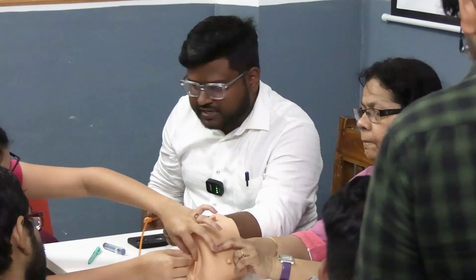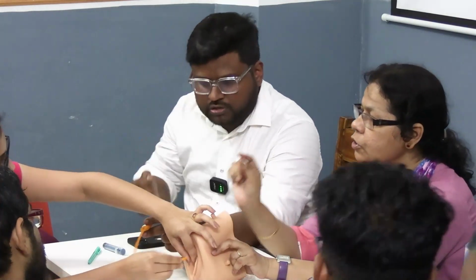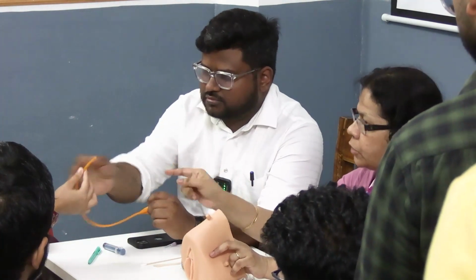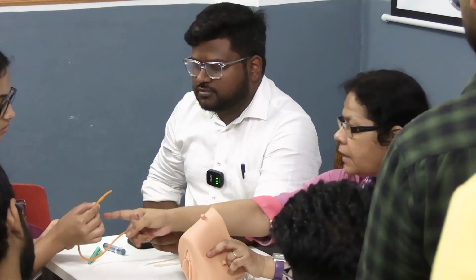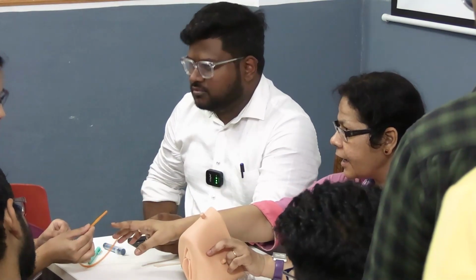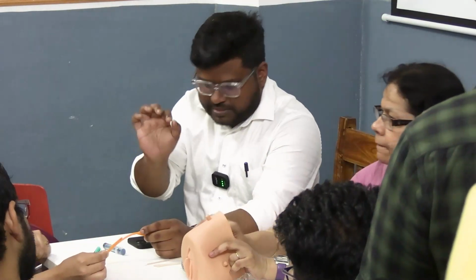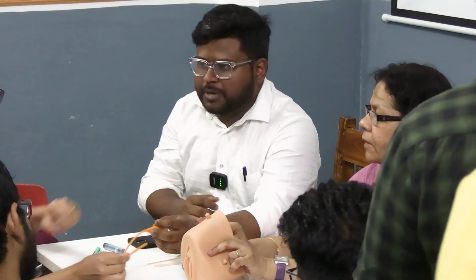If you're holding it at the tip, you will not be able to insert. Hold it a little distal from the tip. There is a reason why you will do this. Because this part is sterile. You have to hold it a little away from the tip. Also, if you're holding at the tip, you cannot insert anything. You don't have any part to insert, right?